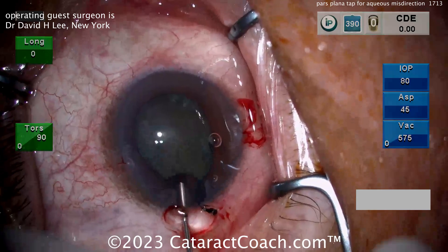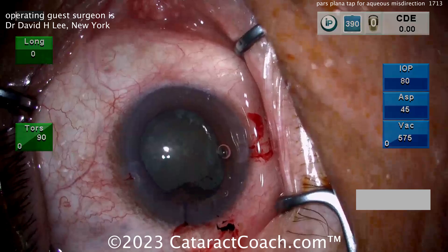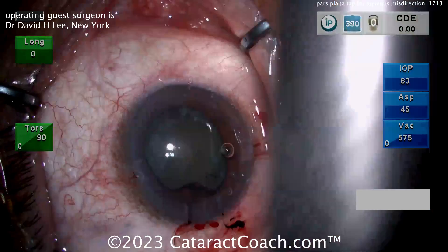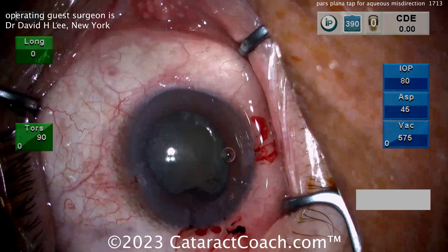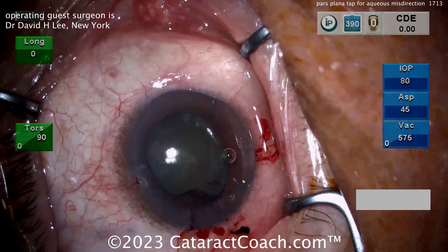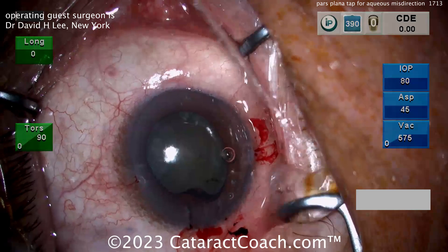Clearly you were right — fluid was trapped there in the anterior hyaloid area, and now look, the iris wants to go back in — that's easy. The AC is nice and deep now. You can continue your case; the rest of the case should be pretty straightforward and the patient will have a really nice outcome. Be sure to also check — since you did have that pars plana site — watch the patient in the post-op period, make sure there's no entry site break, make sure your positioning was appropriate, and look at the retina in the post-op period.